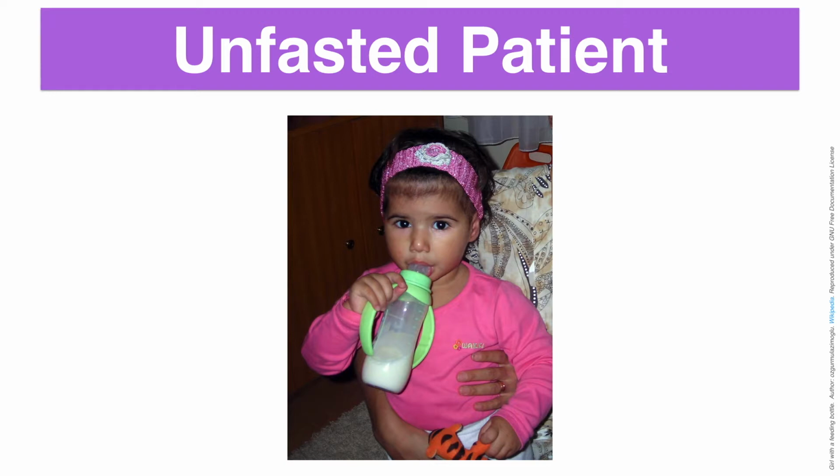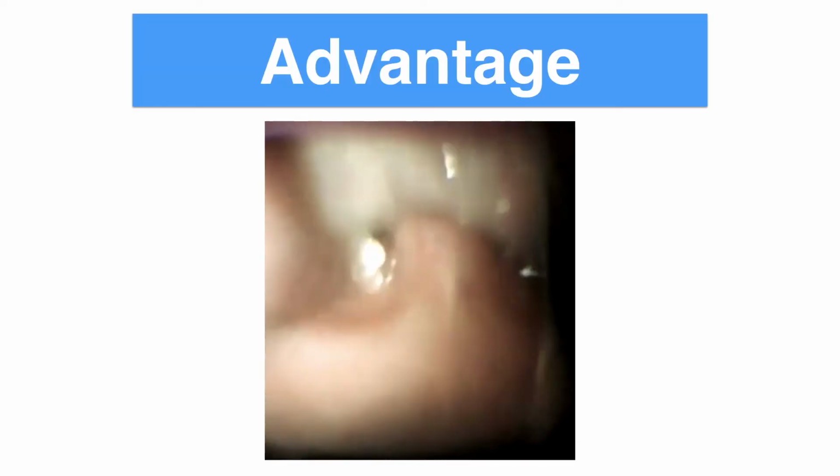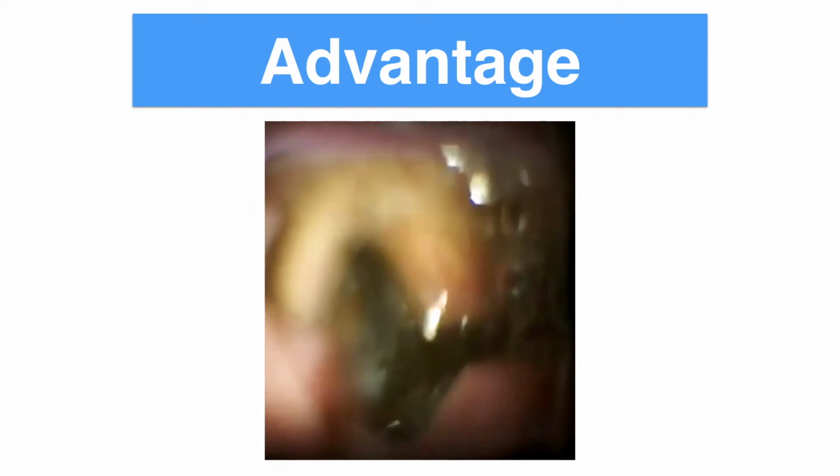Once the muscle relaxant has taken effect, which can be anything from 30 seconds to about a minute, depending on what you use, the patient is then intubated. Cricoid pressure is only removed once the endotracheal tube has been confirmed to be in the correct position with capnography and the cuff has been inflated. So the main advantage of doing a rapid sequence induction is to reduce the risk of aspiration in high risk patients.